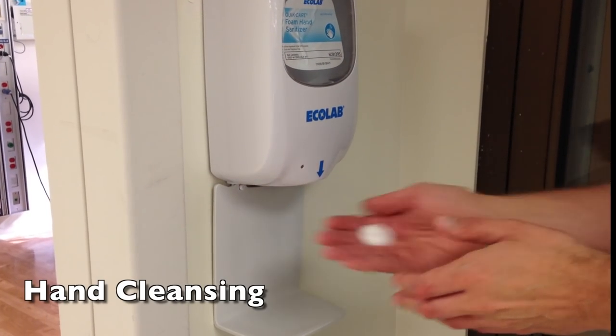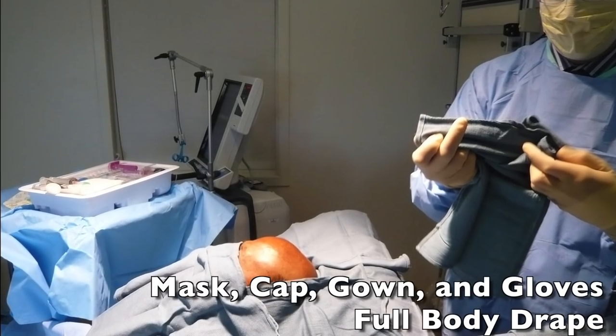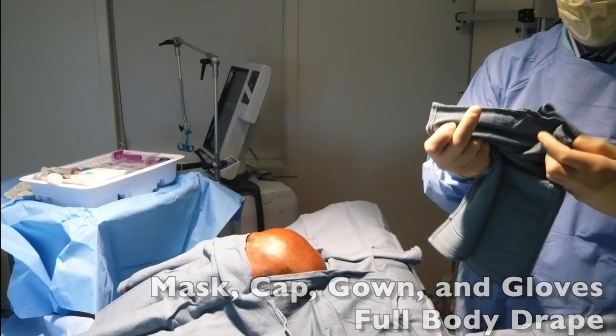Next, the surgeon cleanses their hands with an alcohol-based sanitizer. The surgeon dons mask, cap, gown, and gloves, and full-body sterile draping is applied.